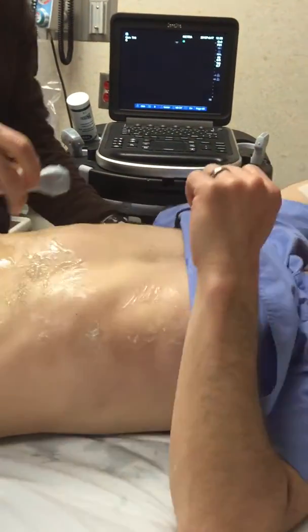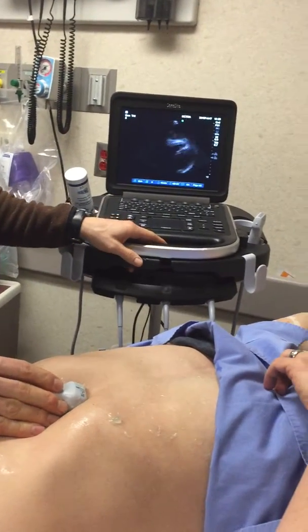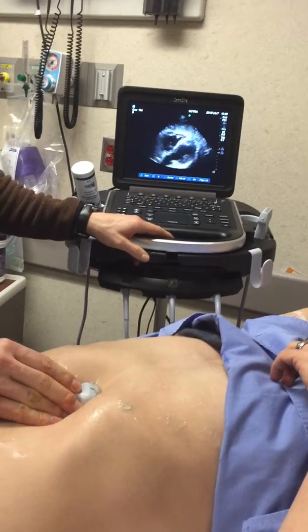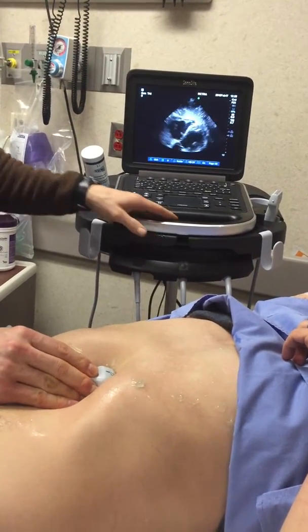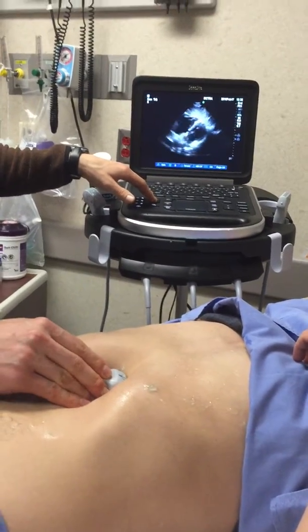So we have the patient roll back on their back, and then the indicator is towards the patient's left side. And then you kind of hold pressure subxiphoid. If you're struggling with the view, adjust your depth. You're going through liver and more tissue typically.